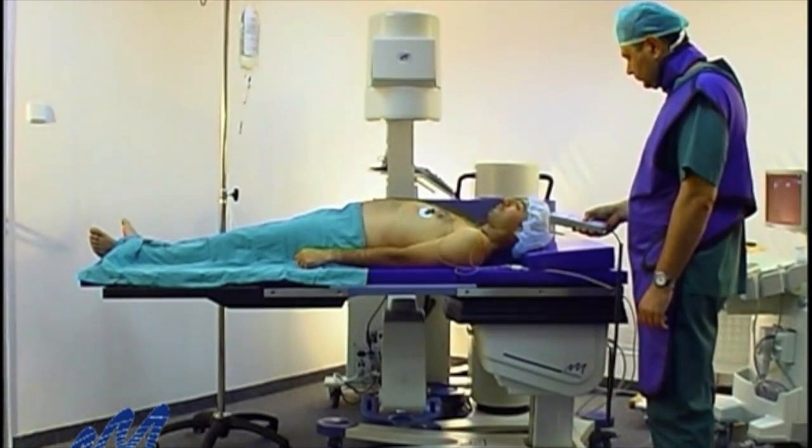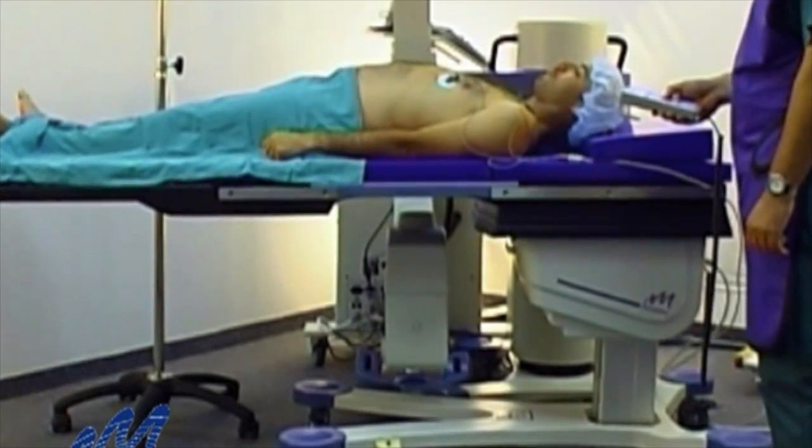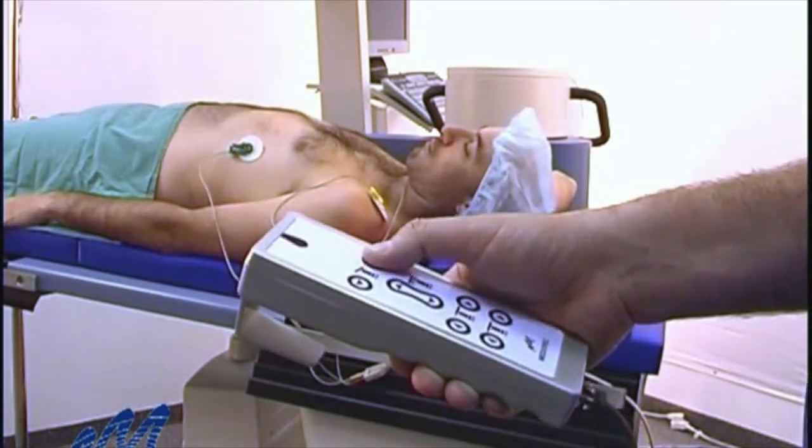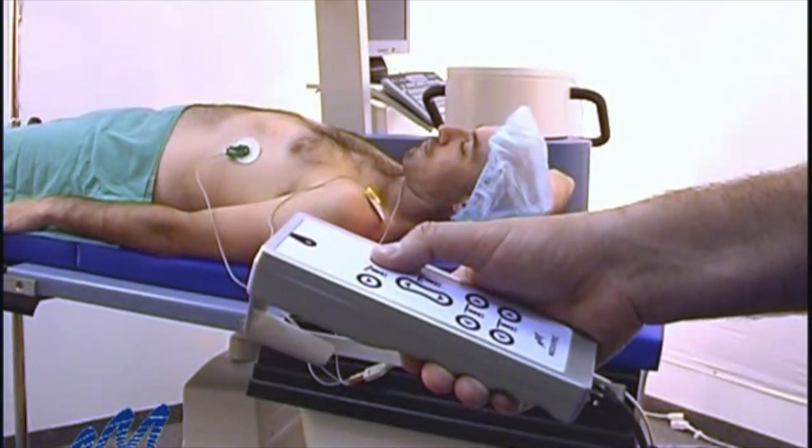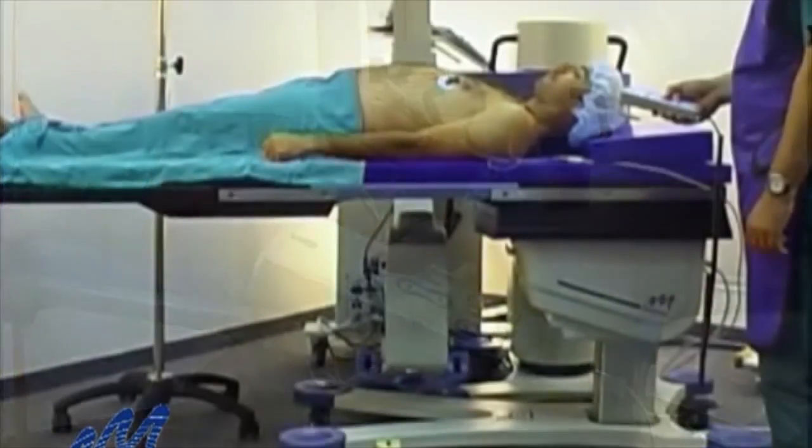MediSpec's standard motorized multi-purpose table assures easy patient positioning for various endourology procedures and can be upgraded to a 5-axis table for more flexible positioning.